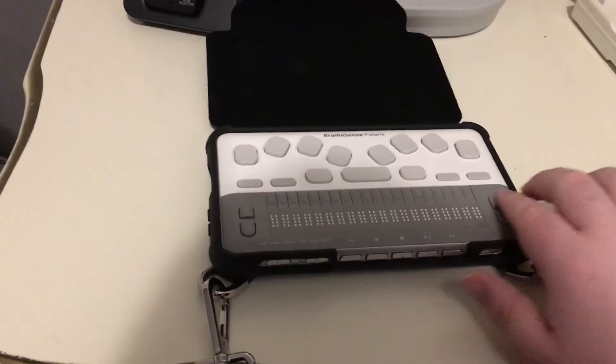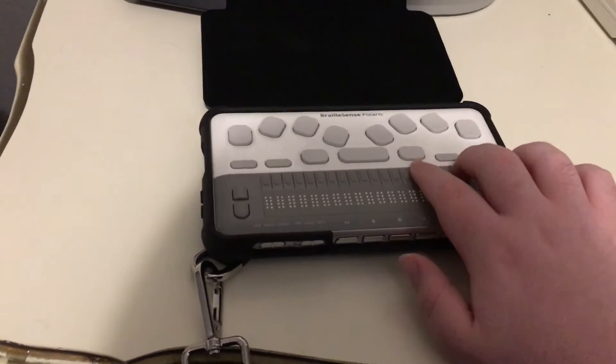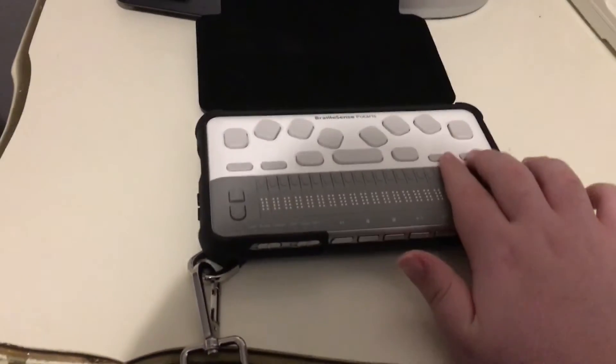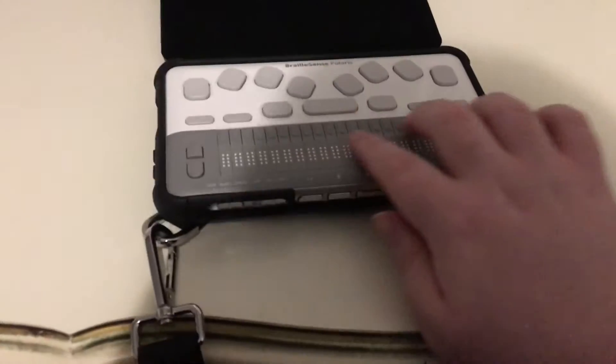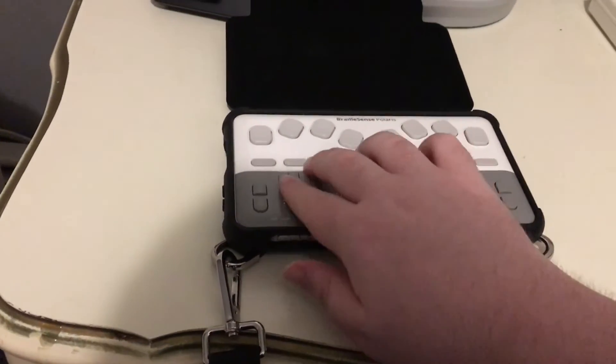Then there's the Braille display. This Polaris Mini has a 20-cell Braille display, which is really nice. The Minis in the past from Hims have had 18, and my BrailleNote Touch has 18 as well. So this is actually a two-cell upgrade, and that's quite nice.